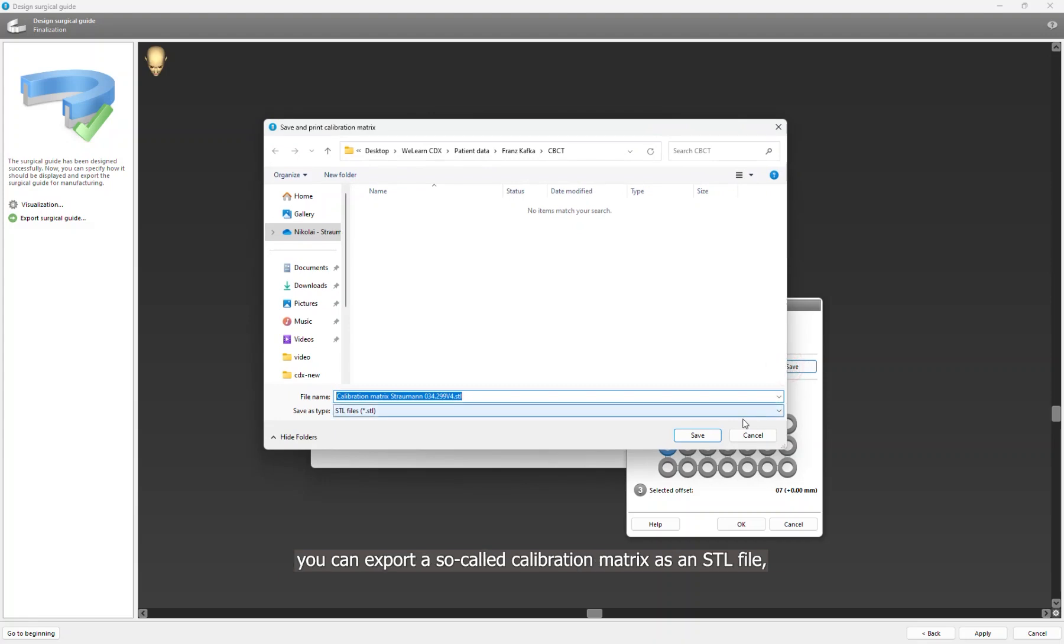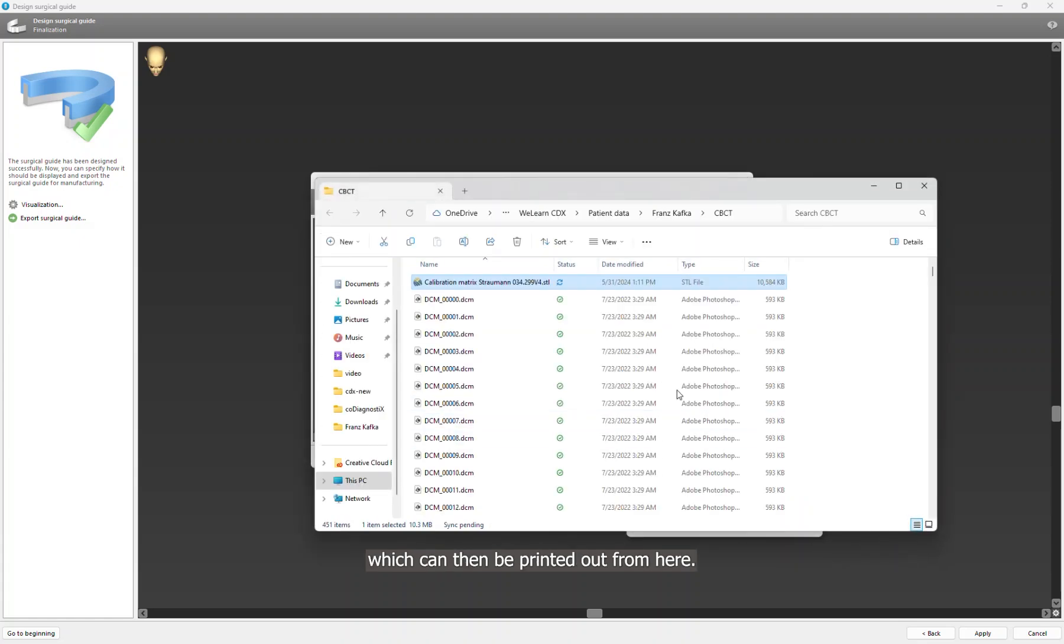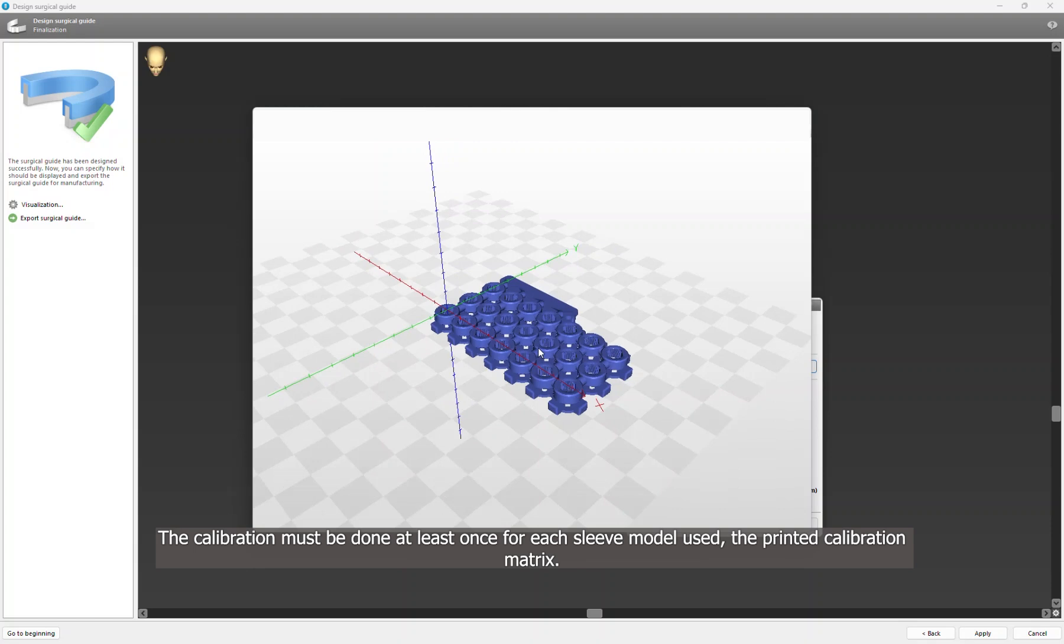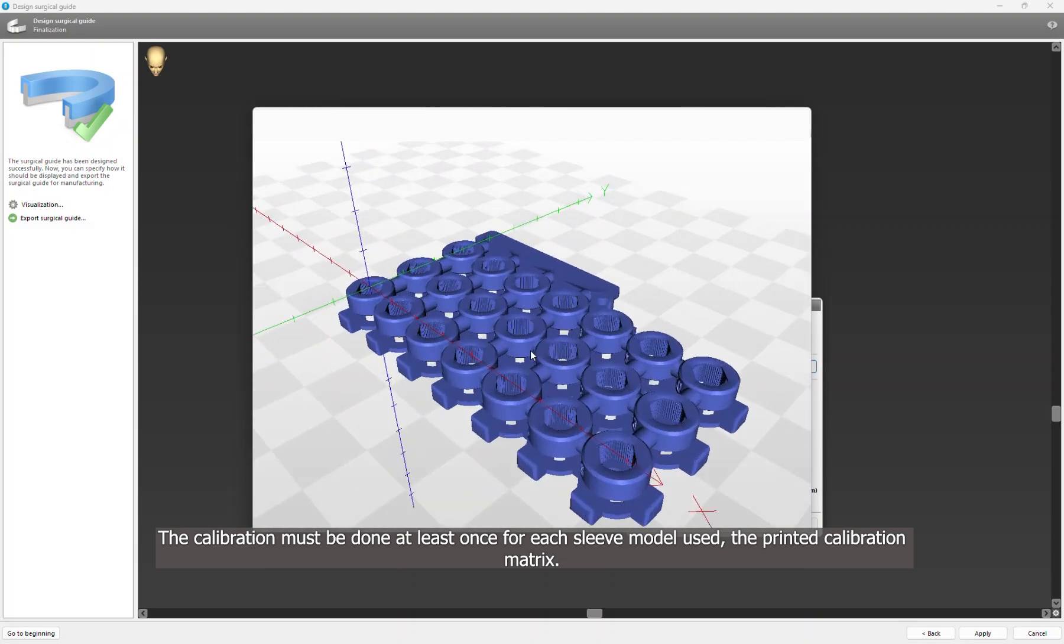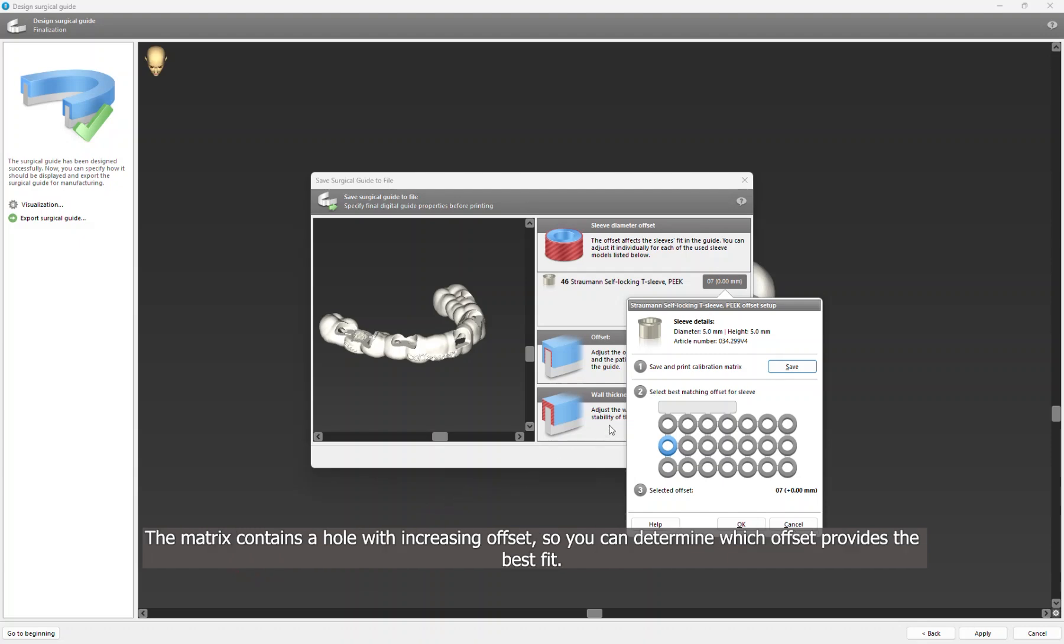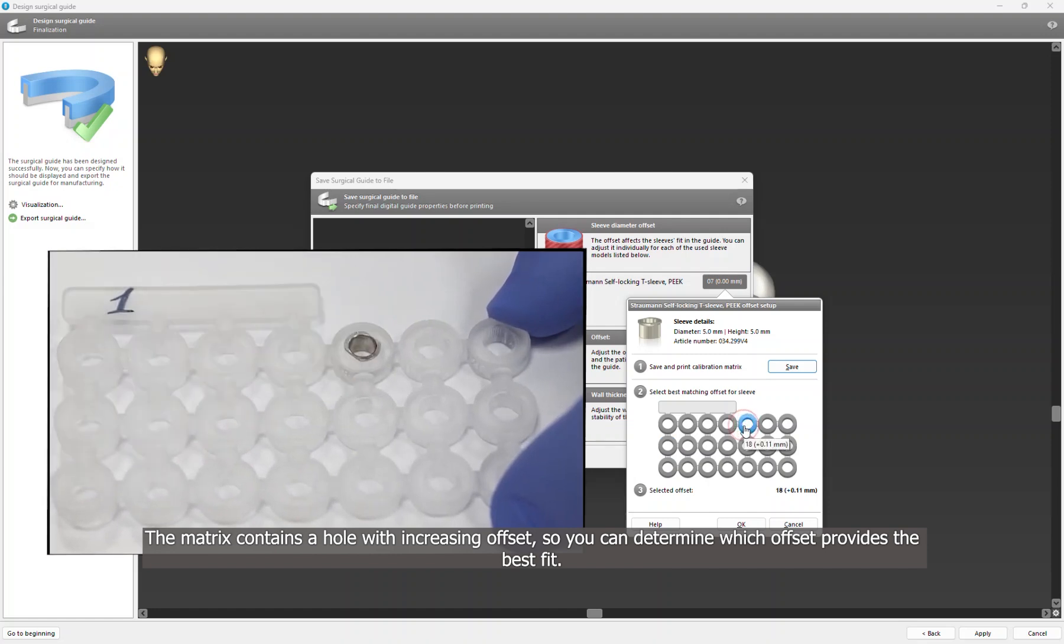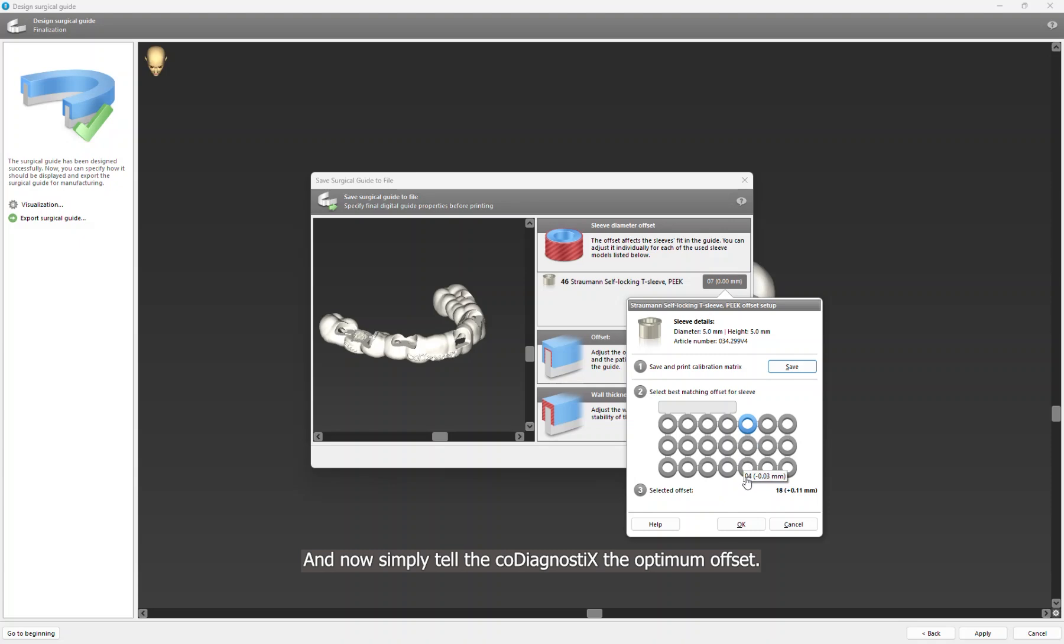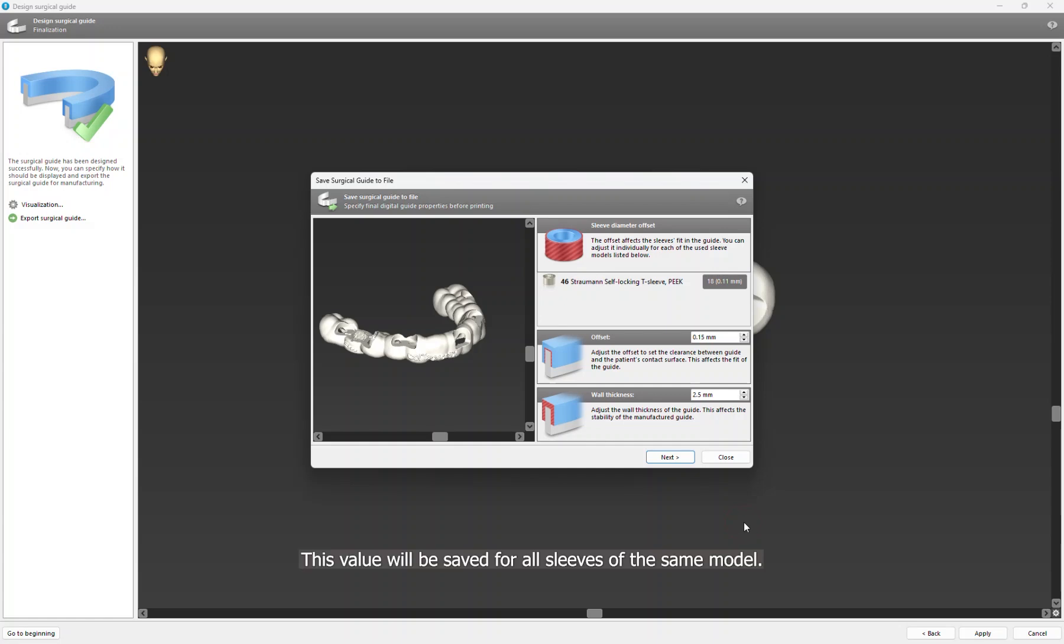As an STL file which can then be printed out from here, the calibration must be done at least once for each sleeve model used. The printed calibration matrix contains a hole with increasing offset, so you can determine which offset provides the best fit. And now simply tell the co-diagnostix the optimum offset. This value will be saved for all sleeves of the same model.